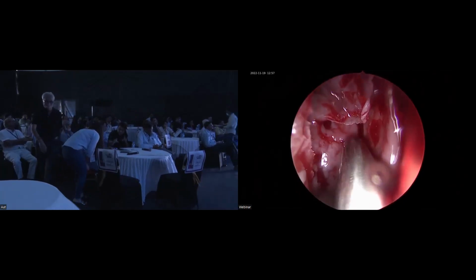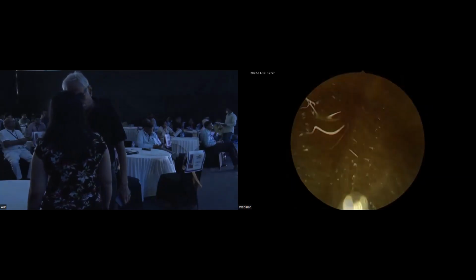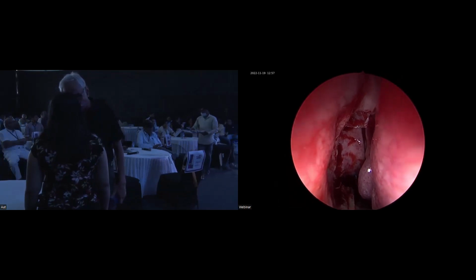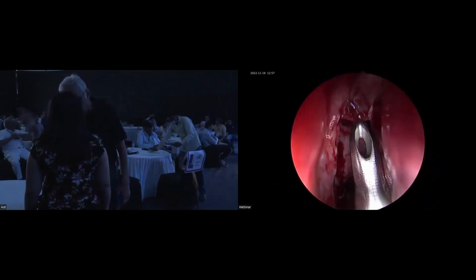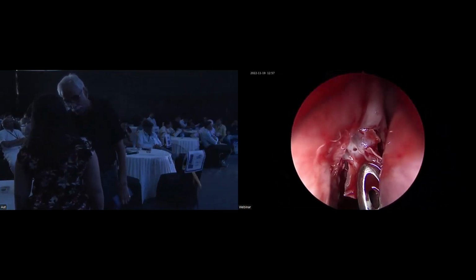Can I get the upper forceps? If they can inflate the cuff, my fogging will decrease. There is some air leak. So what you are seeing is the upper part of the uncinate. This is the terminal recess area I am removing with my upward forceps. I'll try and show you the intact bulla technique in this, because there's hardly any disease in the bulla upward section.